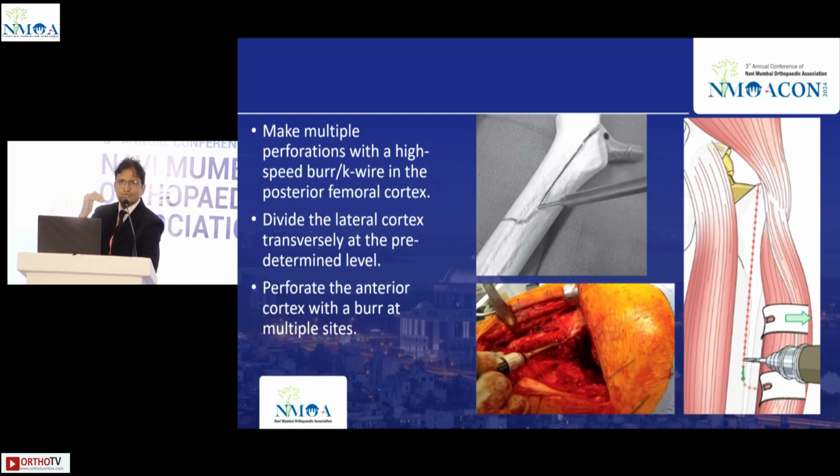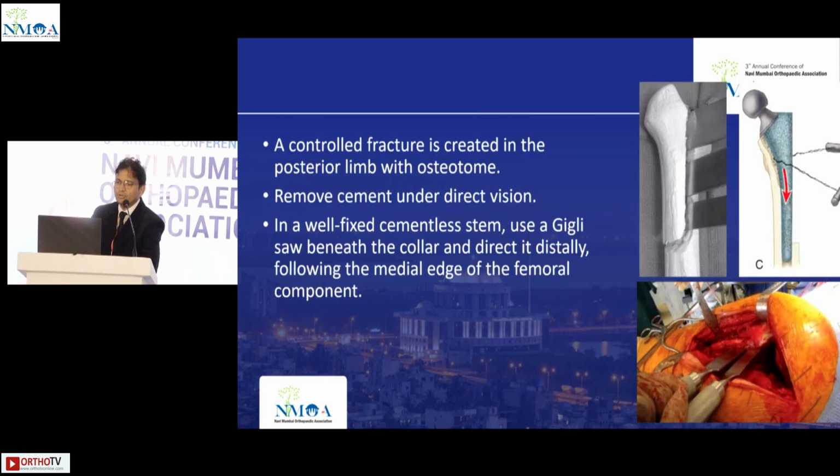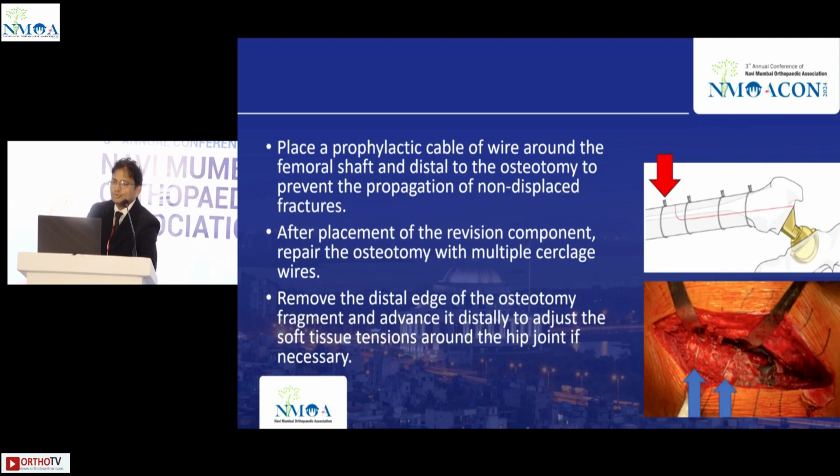Then with a sharp osteotome, you go on cutting, create a fracture there, and then do a transverse part. Always remember that when you do an osteotomy, you need to put in a cerclage wire distal to the osteotomy site. That is very important. This particular cerclage prevents further extension of the fracture. And once the osteotomy is exposed, you remove the stem, whether it's cemented or uncemented. Use all your skills, your teamwork, and the instruments to remove it.